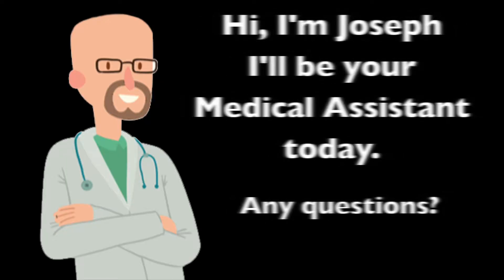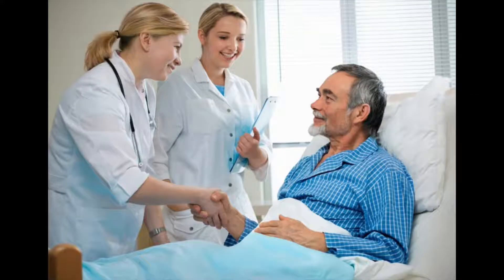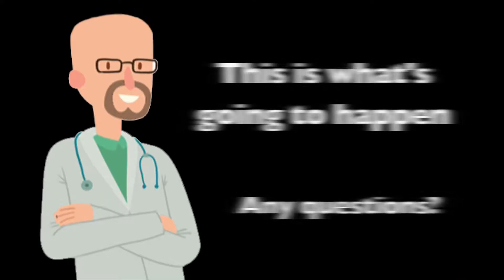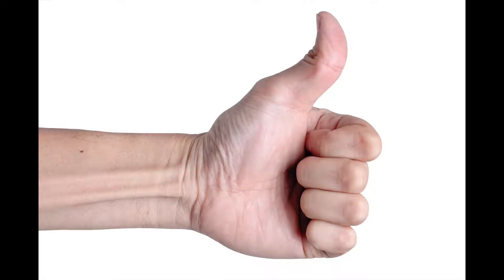The student will introduce him or herself and his or her role as a medical assistant. The student should also identify and introduce the clinical supervisor present for this invasive procedure. The student will explain the procedure to the patient and the steps involved. As part of the initial introduction, the student should confirm the patient or model's understanding of the procedure and elicit their verbal consent to proceed on video.